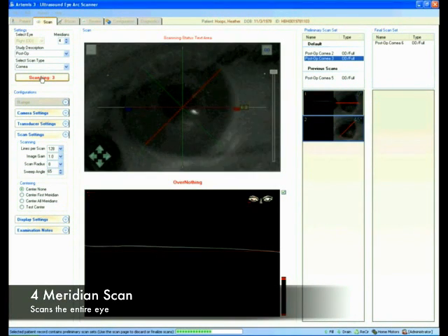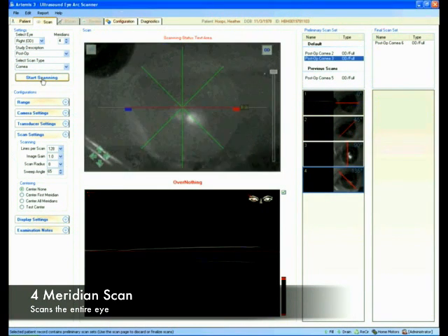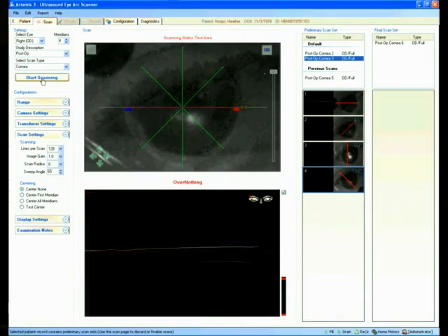Now we're doing a complete four meridian scan. That's three, and we have one more. And we're done. At this point, we have a completed scan.